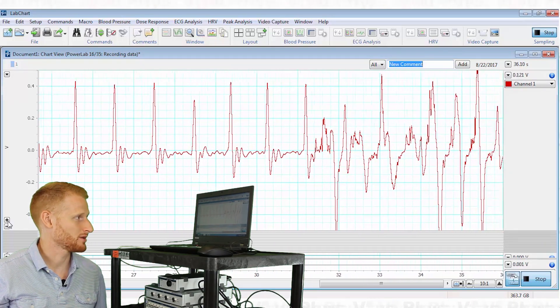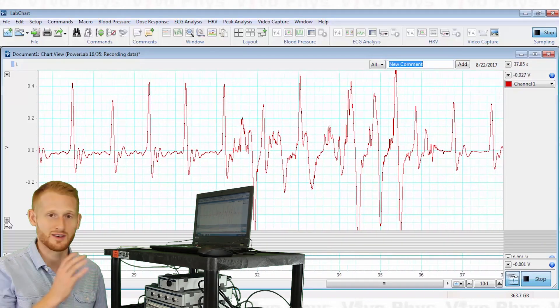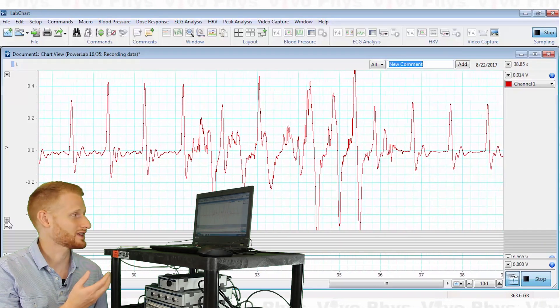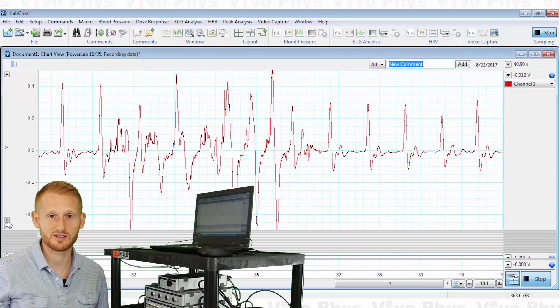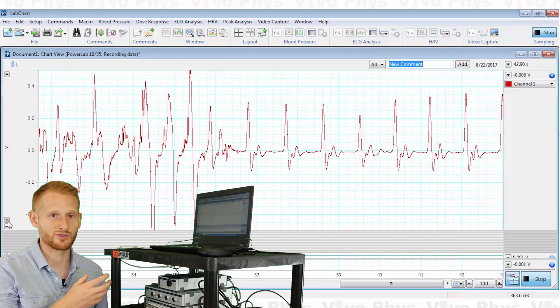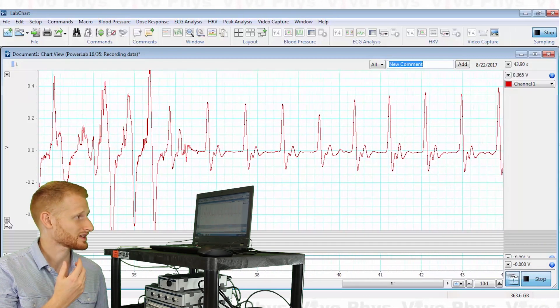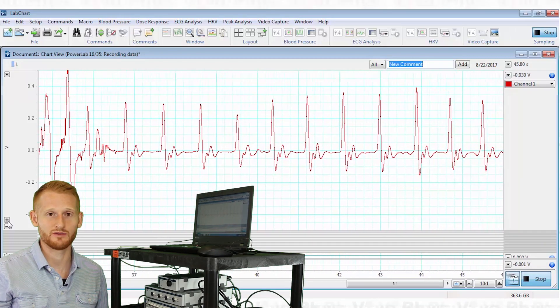Alright, so you want to make sure they're nice and still like I'm doing now again, and you're going to get a reasonably clear signal. This can be used for calculating heart rate and doing heart rate variability.